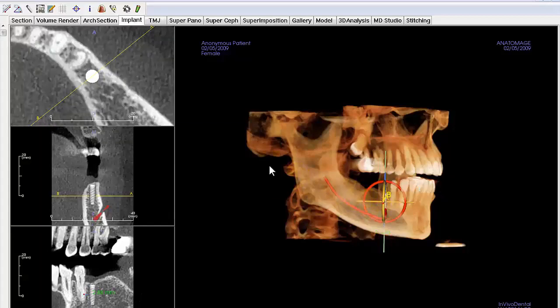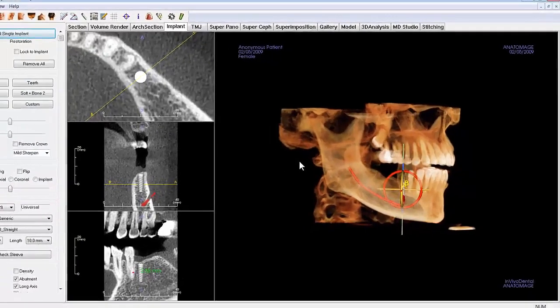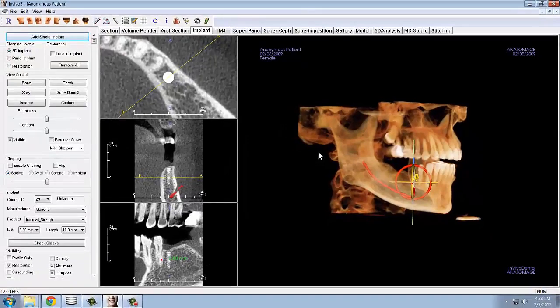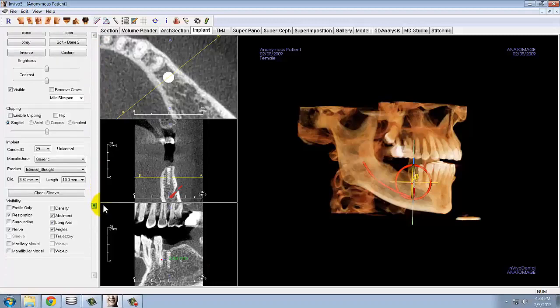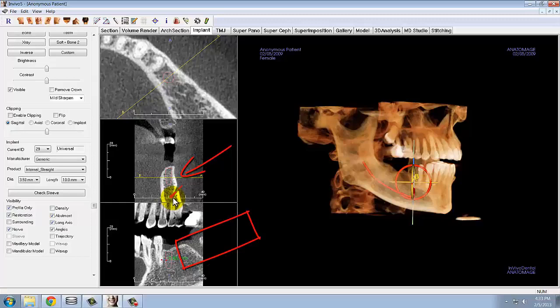Another option you have when placing your implants is to use the profile-only function in the visibility section of your control panel. This allows you to see only the outline of the implant in the 2D cross-sectional views. This could be used for detecting if the implant is going through a bone defect or not.